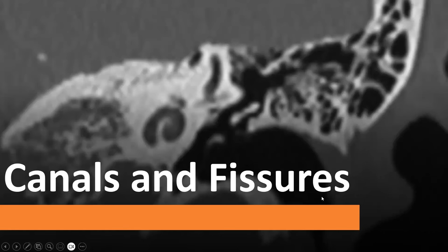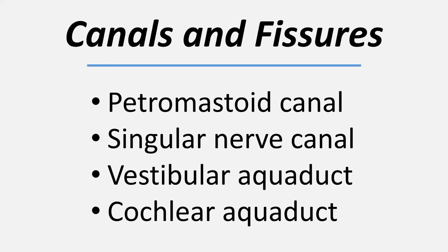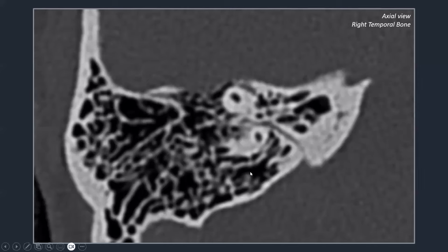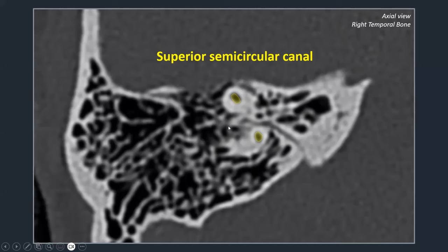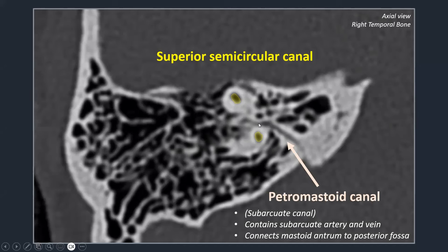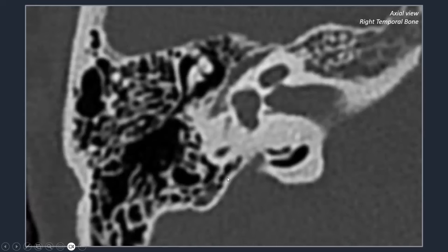Some very small canals and fissures should not be mistaken for pathology. The petromastoid canal, also called the subarcuate canal, is best seen on axial images as a small canal connecting the mastoid to the posterior fossa, located between the two arms of the superior semicircular canal. It contains the subarcuate artery and vein. Do not mistake it for a fracture.